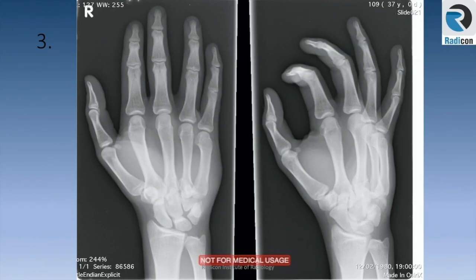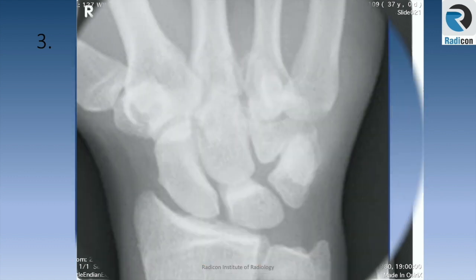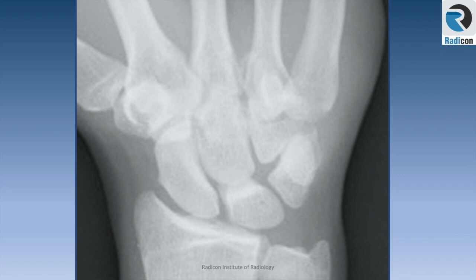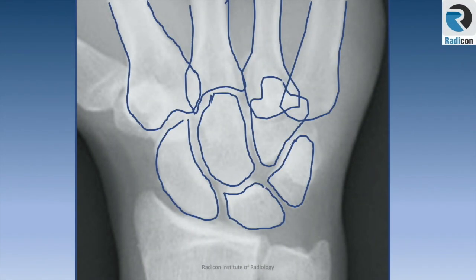Let's look at case 3, which has a very important learning point for rapid reporting. Let's zoom it up. As we know, we expect to see a gap of 1-2 mm between all carpal bones. When I zoom this film up, you can better see that the space is not visualized between the 4th and 5th CMC — carpometacarpal — joints, and that part is highlighted in red.